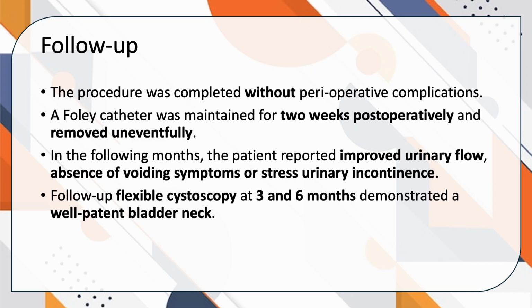The postoperative period was uneventful, and the catheter was removed 2 weeks after surgery. On follow-up, the patient has a good urinary flow and a wide bladder neck on cystoscopy.